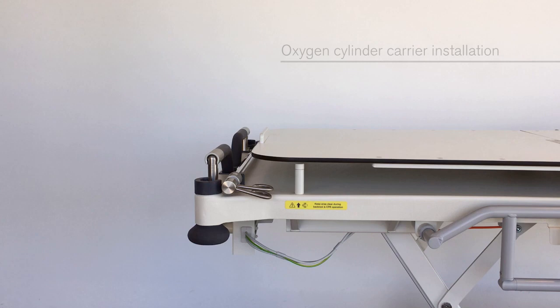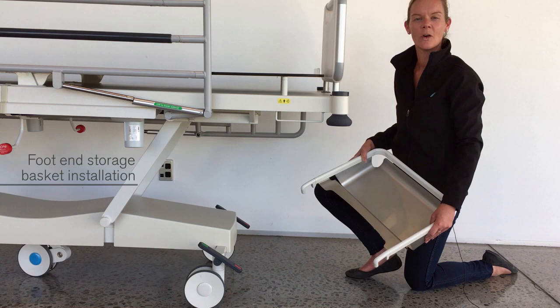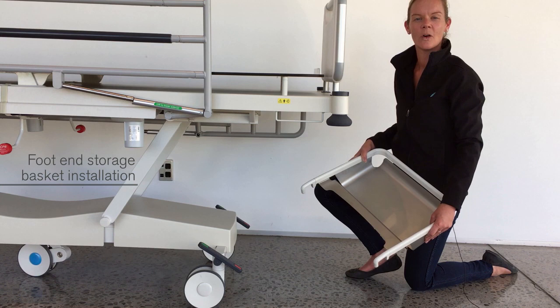A range of oxygen cylinder carriers are available. Plug the oxygen cylinder carrier into one of the stretcher's four corner accessory sockets. A storage basket is available and fits on the foot end of the bogey — simply hook the basket over the bogey. For a full list of options and accessories, please visit our website. If you have any further questions, please consult the instructions for use or contact Howard Wright Customer Service.